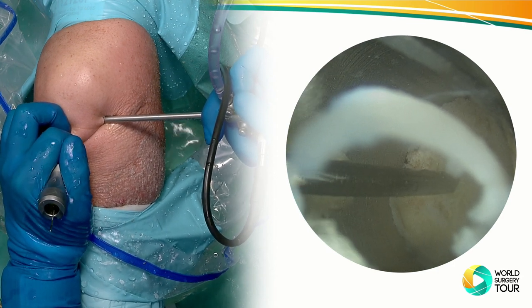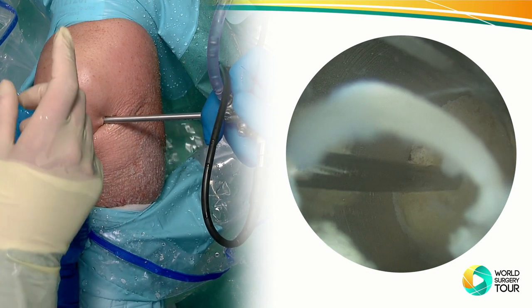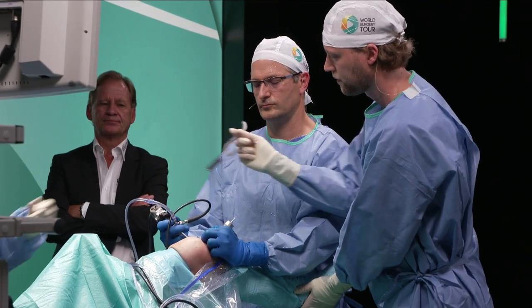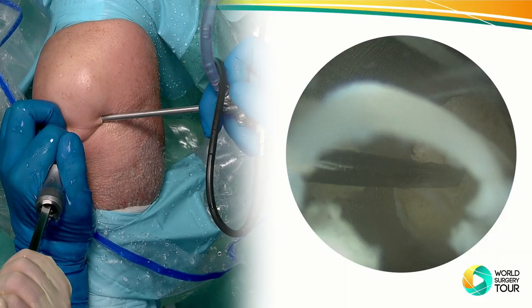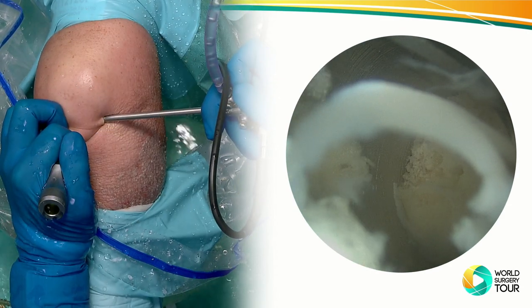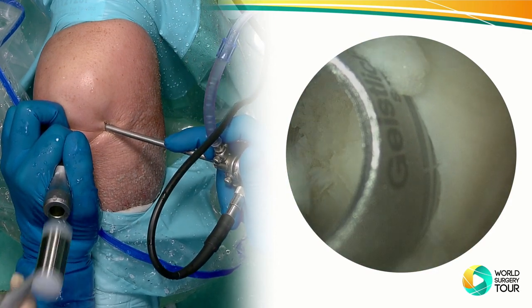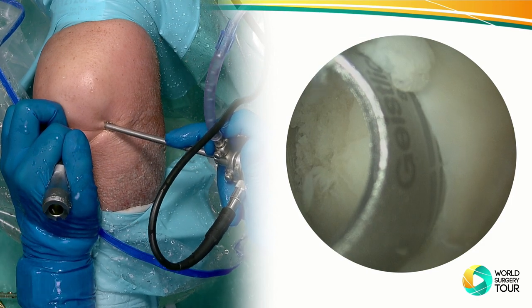You want to ream again or not? I would like to punch it in again because if it's not stable, so we need to take out the. Then give me the K wire extractor. Okay, perfect. Okay, here we go. Then we need the hammer. Okay, and then punch it again. Okay, check. Let's go. Good position, perfect. A little more. A little more. Okay. No, a little more, just punch it.